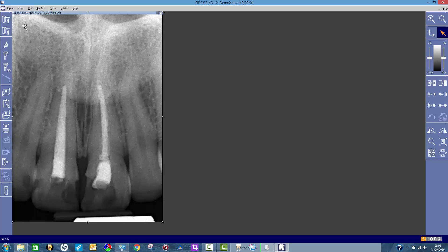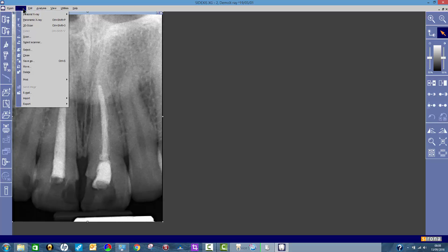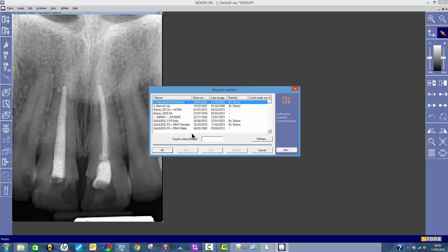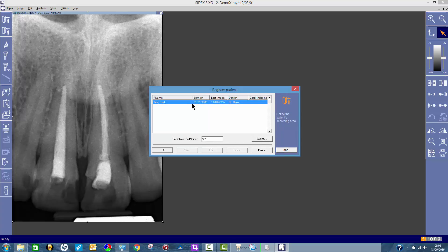So I want to move this one, so I go image, move, and then I search for the patient that I want to put it in. So say it's Mr. Test. There he is, Mr. Test.